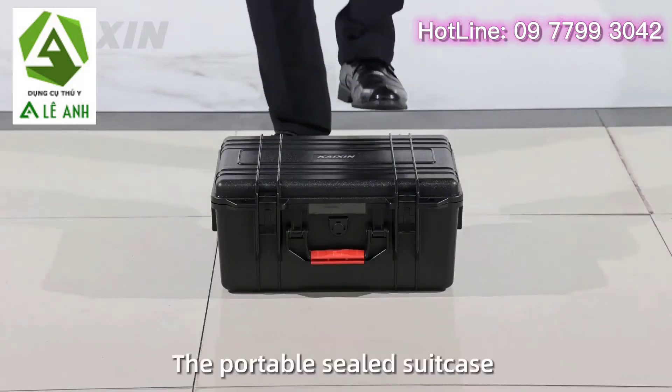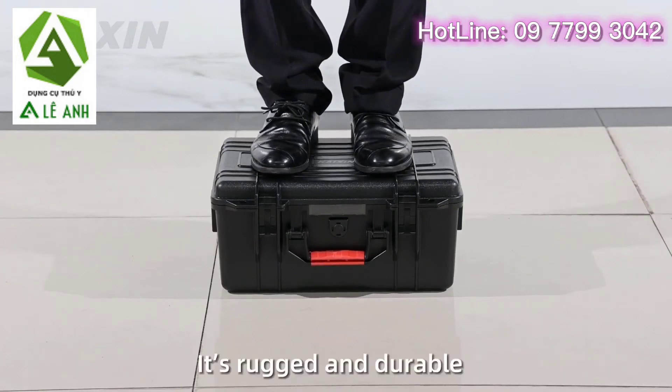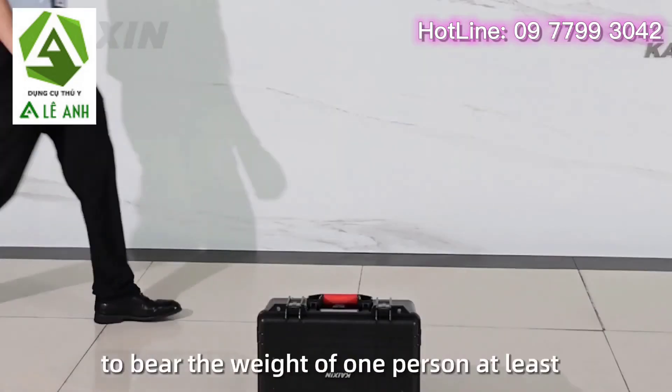The portable sealed suitcase also makes it convenient to go out for diagnosis. It is rugged and durable, able to bear the weight of at least one person.